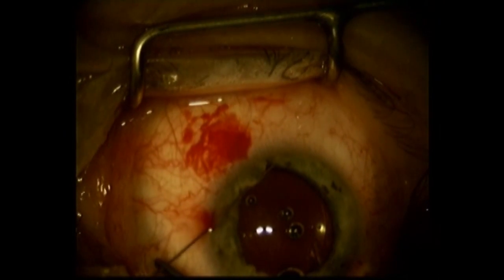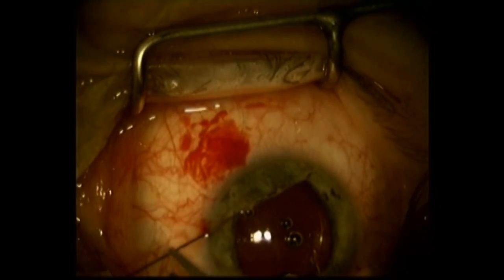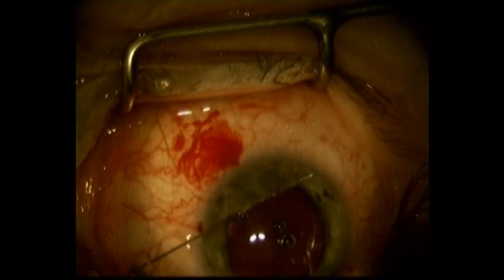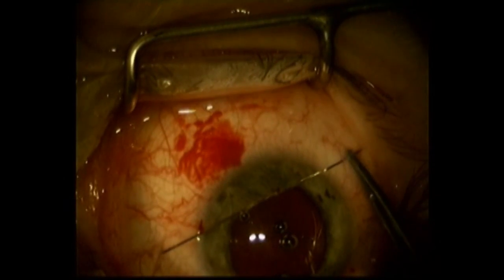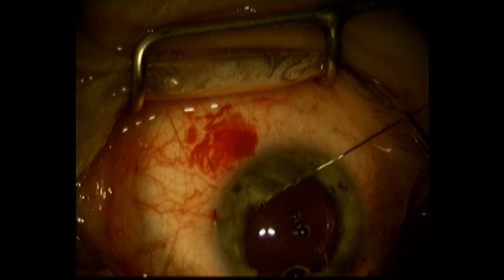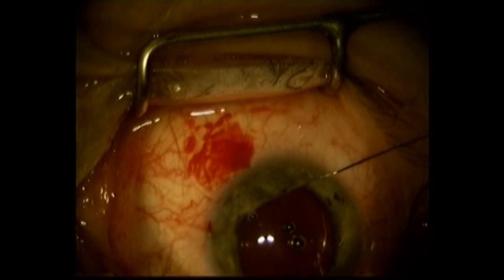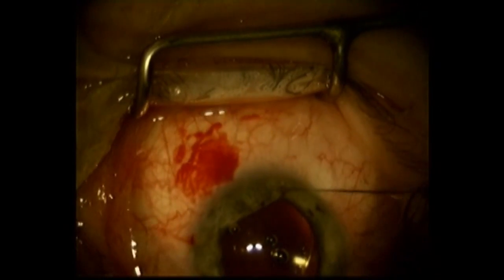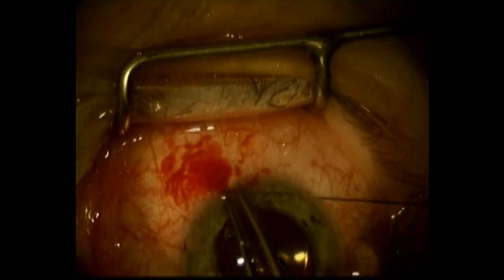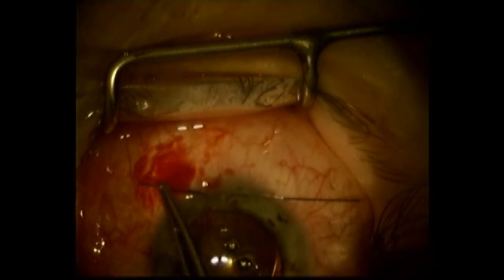Going all the way around 360 degrees. It's good to just take your time and not put too much strain on the iris, as that could cause a hemorrhage. Passing this in a trans-corneal fashion, but not all the way through — then you back it out after you've gone through the iris, and don't pull it all the way out. Back it back in through another opening that you create, and you do this for 360 degrees. That way you're able to create this full purse-string effect.